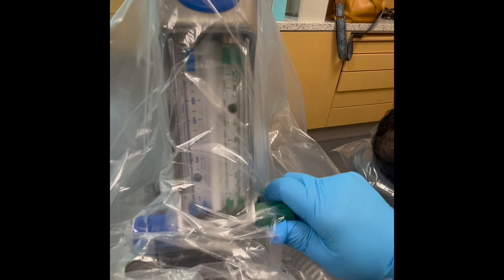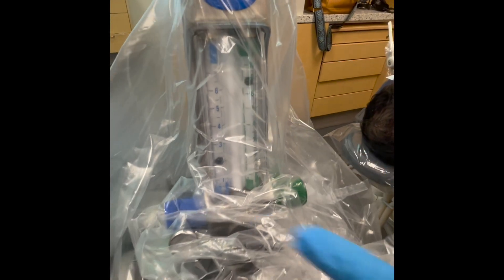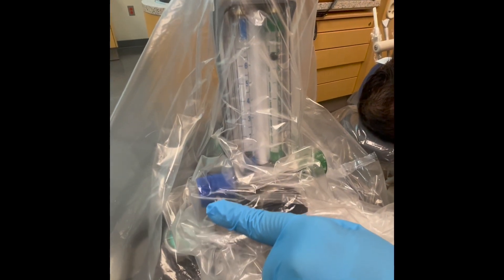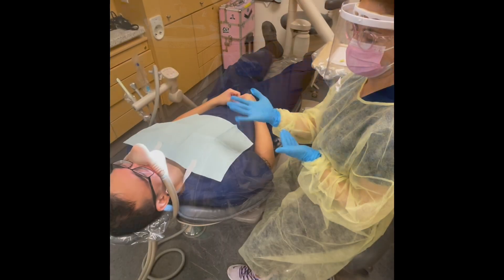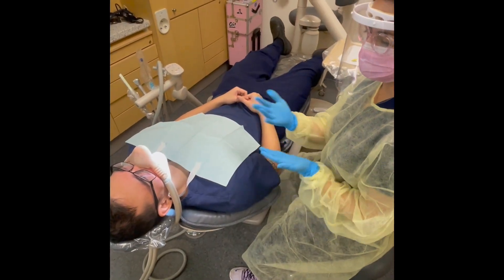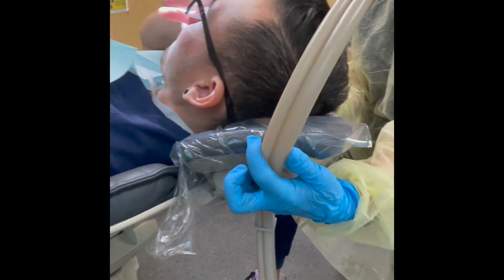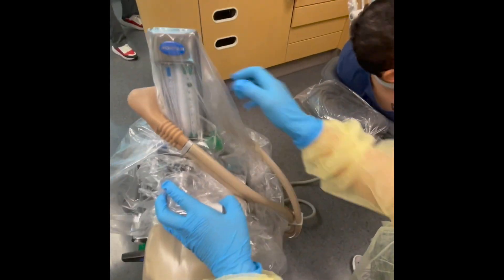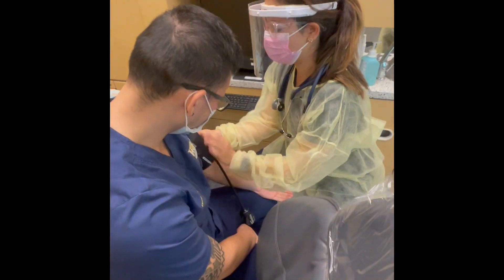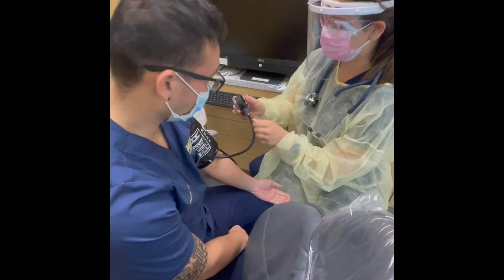Once you are ready to terminate nitrous oxide sedation, start by bringing the oxygen back up to tidal volume — in this case 8 liters per minute — and then turn off nitrous. Allow your patient to breathe 100% oxygen for 5 full minutes, taking note of the time of termination. Ask your patient if they feel as they did prior to the procedure. If not, allow them more time on pure oxygen. Remove the nasal hood and turn off the oxygen. Take and record your patient's vitals once again before they are dismissed from your operatory.